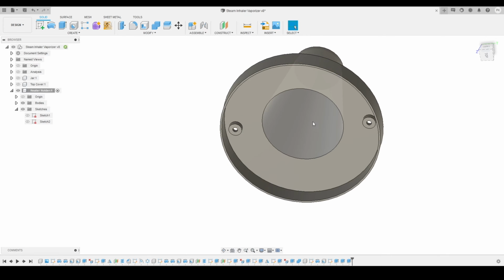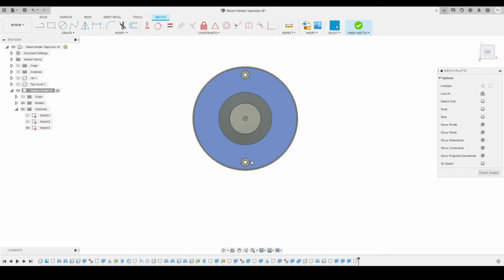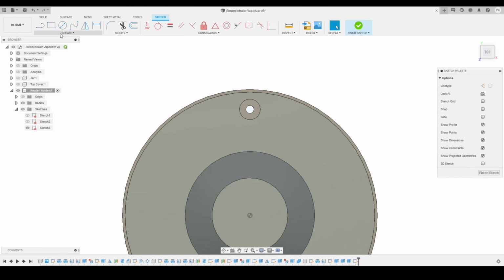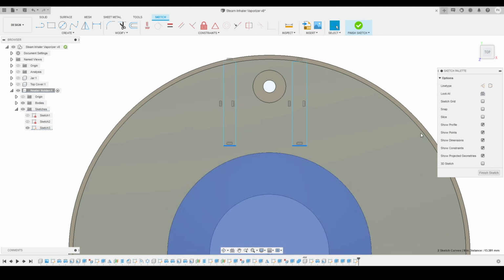Now again I will select this face and click on create sketch, and I'm going to create a few more profiles over here. So for that I'm going to use the rectangle tool. So I will just activate my rectangle tool from here, 2-point rectangle tool, and I will create a rectangle like this. Here you can see I'm just trying to create a rectangle from here to here like this, and on the other side I will do the same rectangle, and I will make sure that both the rectangles are identical. So we'll apply the equal constraint on all the sides. Here you can see I will just select the sides and apply the equal constraint to make them identical.